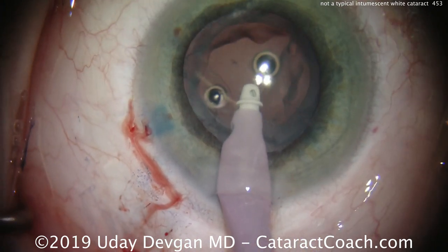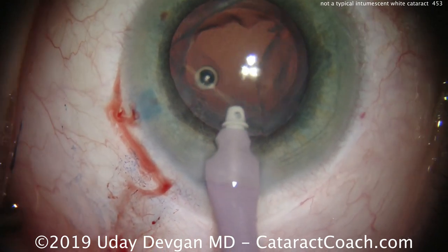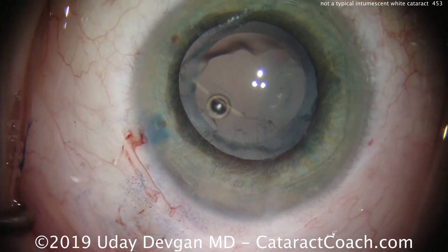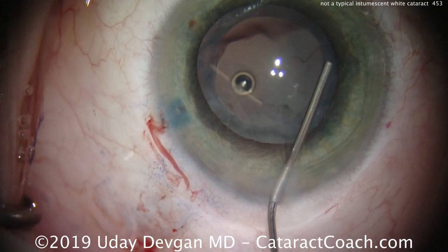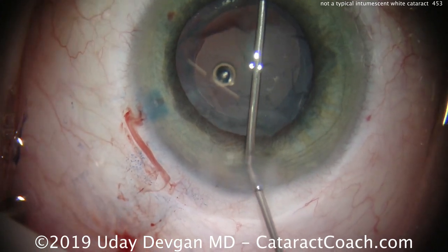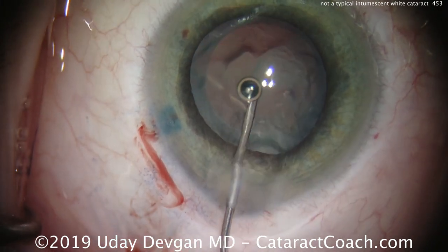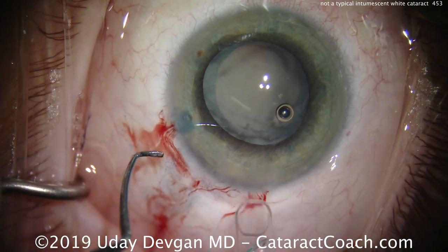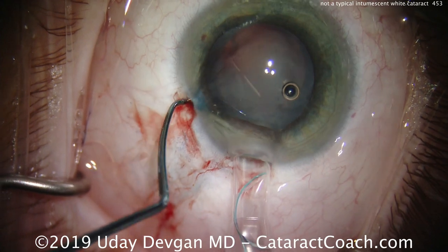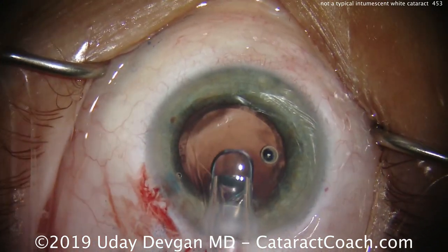We'll clean up the anterior segment. I'll put the IOL in first. The IOL here is going to be a three-piece monofocal hydrophobic acrylic IOL with a six millimeter optic — and that's why it was so critical for us to have that five millimeter rhexis. Now for our cohesive viscoelastic, watch where I'm putting it — just under the iris, just to open up that sulcus area. We don't want to just fill the center of the eye, because with an open posterior capsule in this unicameral eye, the viscoelastic will just fall back.